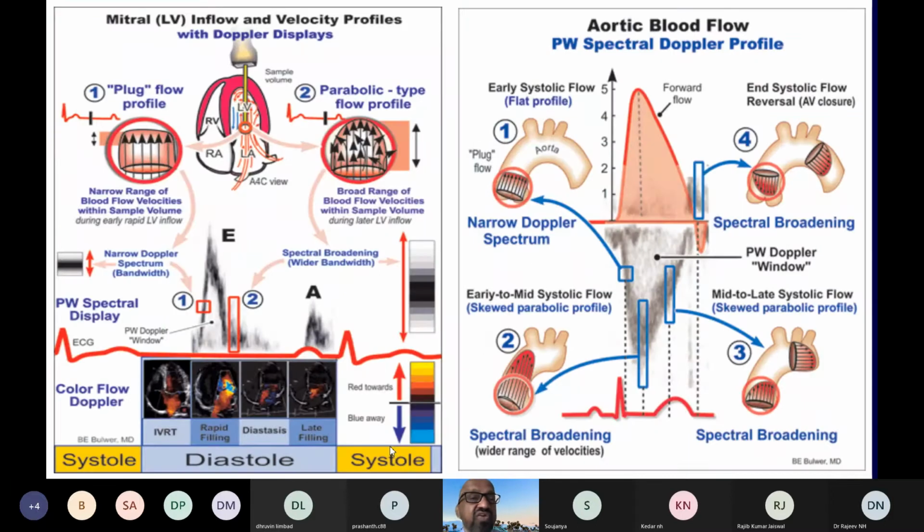Coming to the use of this in the clinical settings, for example, this is an apical 4-chamber view using transthoracic echocardiography. This picture is transthoracic echocardiography. You have put the probe at the apex, which is at the fifth intercostal space, just a little away from the mid-clavicular line.